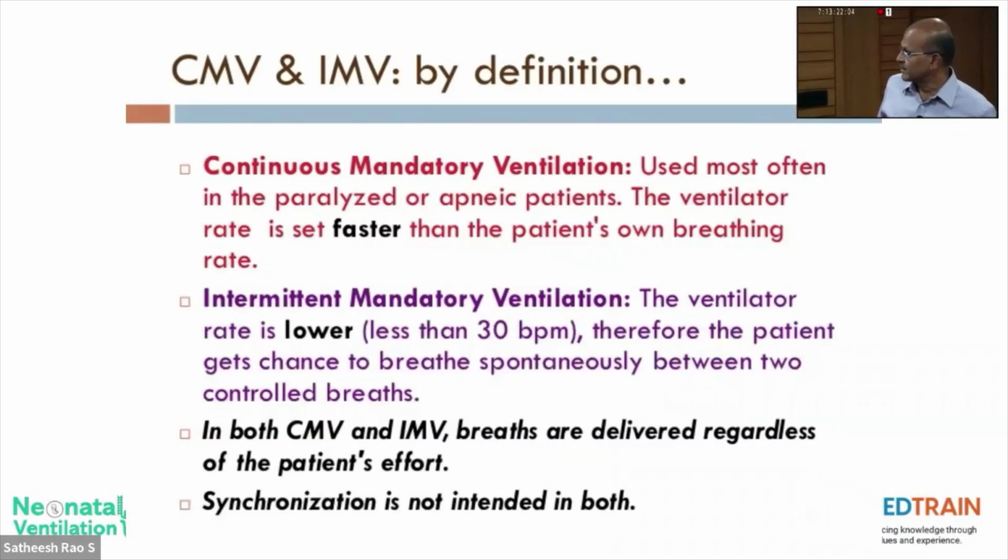So we mentioned this already, that in paralyzed patients, it's the same whether you use CMV or IMV. The synchronization won't work in a paralyzed baby, but it's not wrong if you keep SIMV in a paralyzed baby, because essentially it will work like IMV. But when the baby starts waking up, you don't need to remember to change the mode. Synchronization will work if there are baby's efforts. If not, it will work as a backup mode. The backup settings have to be higher if the baby is sedated or paralyzed.